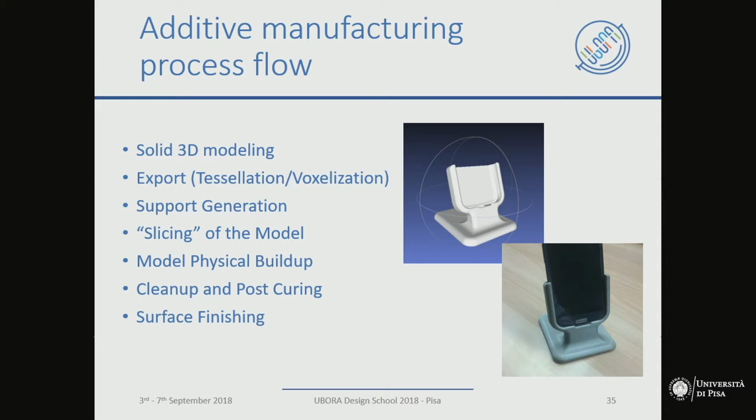I have 10 minutes to show you how to 3D print an object. So, the first step is to have a digital model. A model which is on your computer.